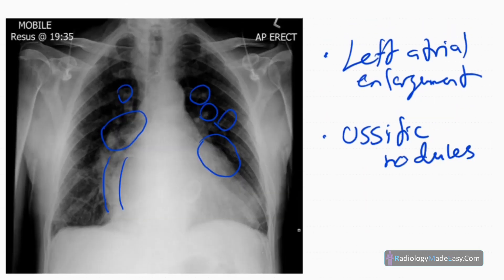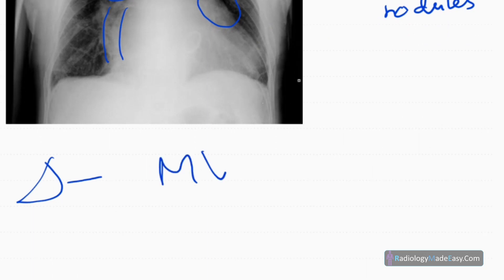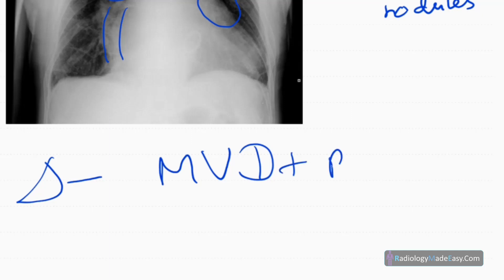The trachea is central, the diaphragm appears normal, and there is no evidence of pleural effusion. The visualized bones show no bony abnormality. In this patient, the diagnosis is mitral valve disease complicated by pulmonary venous hypertension.